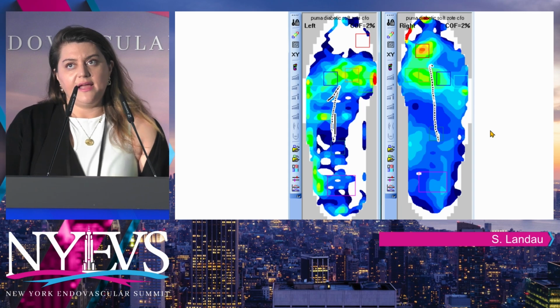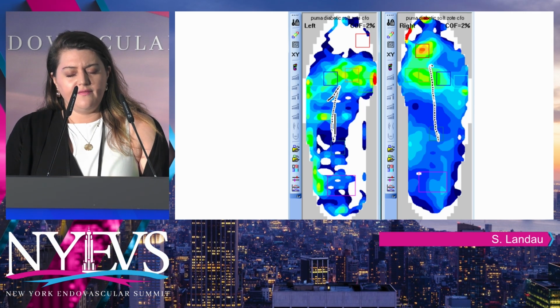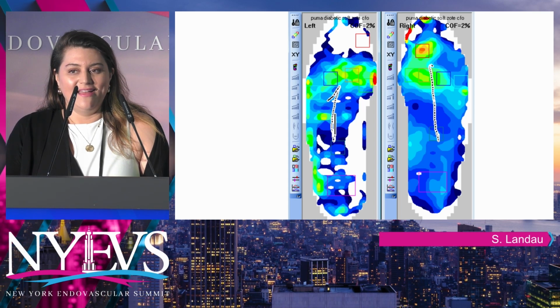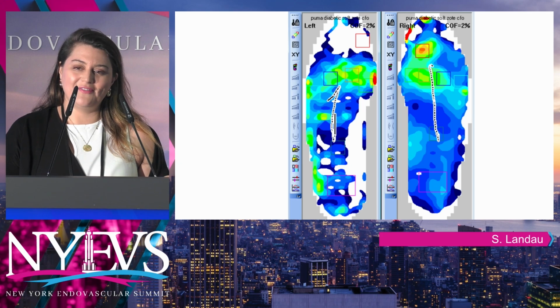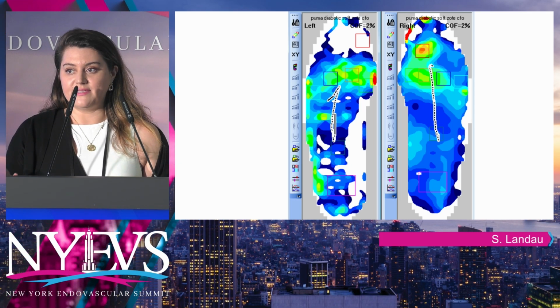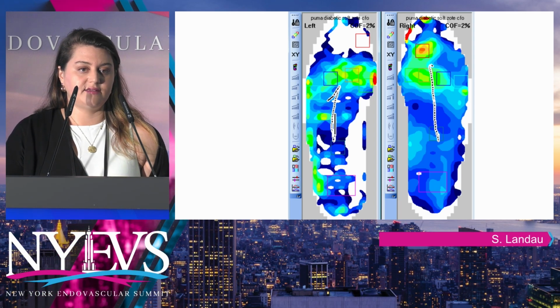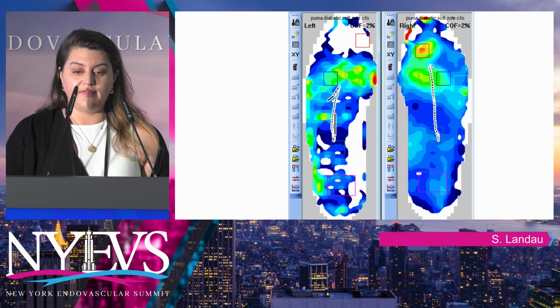So the lab that I used, I don't know why they did this, but I had ordered a toe filler along with my custom foot orthoses when I casted him, and they sent a separate toe filler with just an inlay and my custom foot orthoses separately. So this test was just his custom foot orthoses without the toe filler.